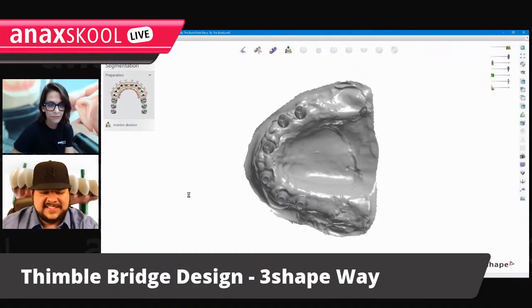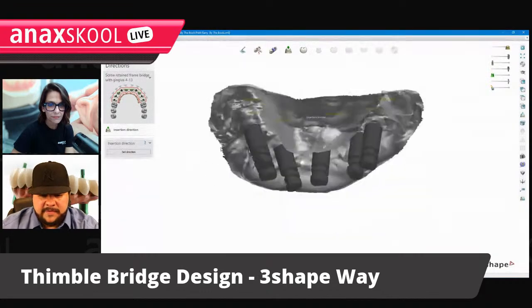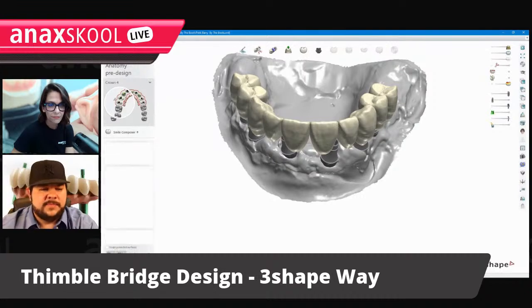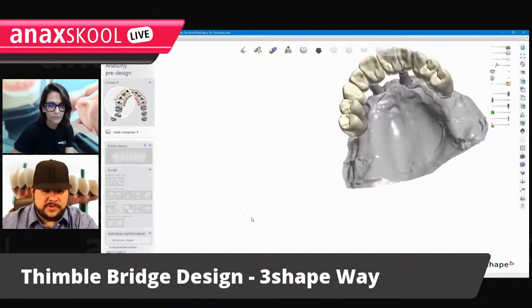We've got our DES tie bases for our BioHorizons case. Why did we choose DES? I don't remember. But it's always going to be dependent on your final prosthetic, what components you're going to be able to use, because they're all different. Some are tall, some are short, some are fat, some are wide. Some you can see when they're smiling, and some you can't. They have a nice flush finish with your prosthetic.